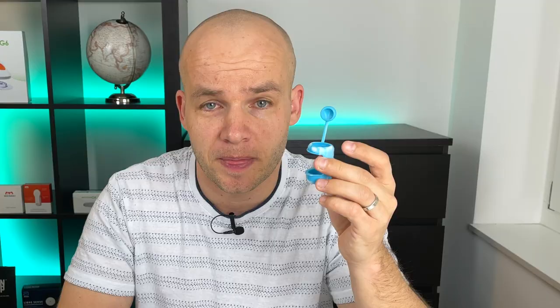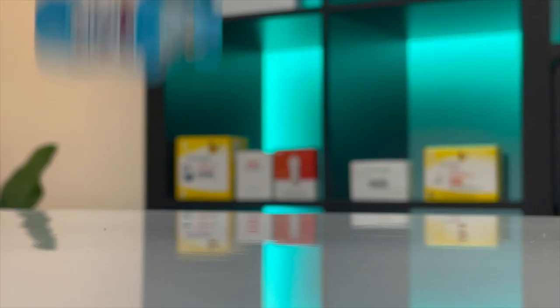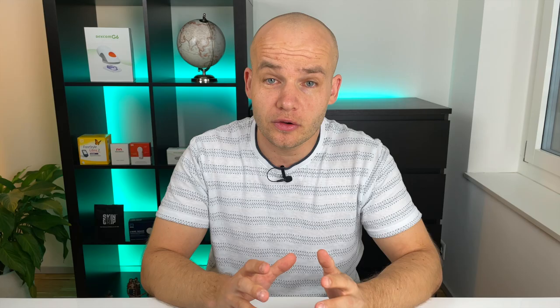Another great solution to protect your insulin vials are these rubber protectors, which are made by the same company that makes the cooler. I think these are a really smart solution to keep your insulin vials safe, not only when traveling, because insulin can be quite expensive if you don't get full insurance coverage.